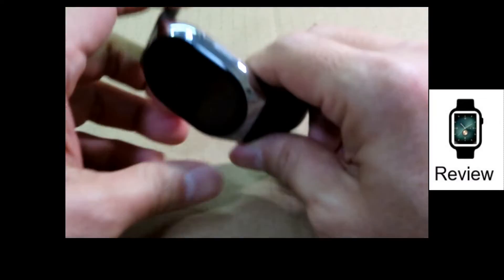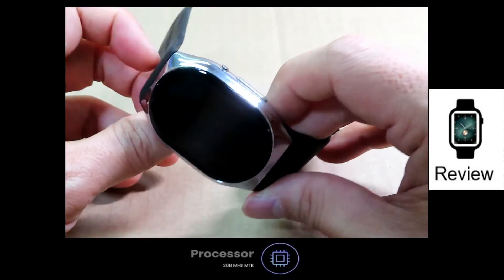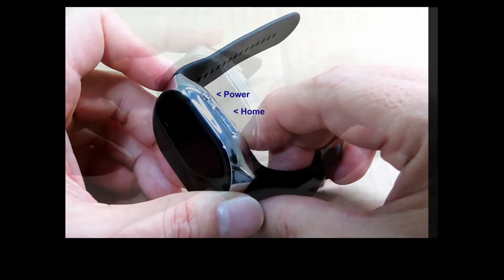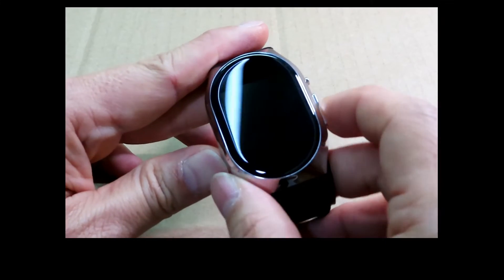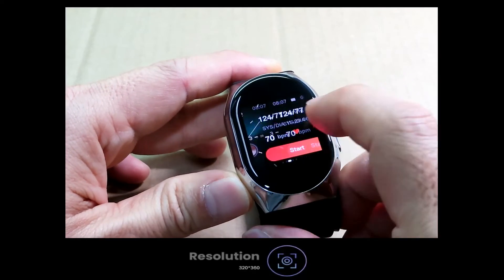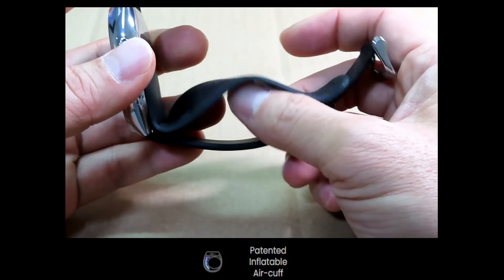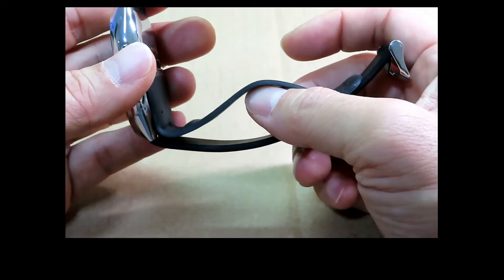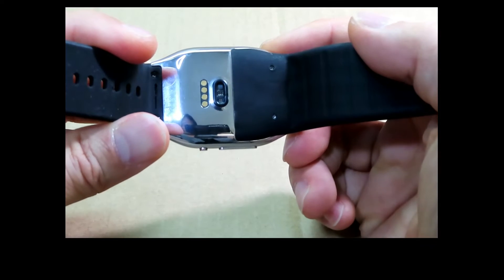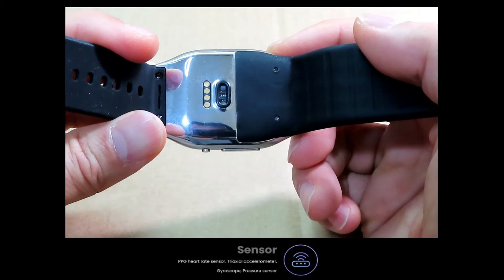Let's take a look at the watch. It's made of medical grade stainless steel — very solid material. It has two buttons: the power and the home button. The screen is a 1.4 inch AMOLED touchscreen. The unique feature is a patented inflatable air cuff that inflates to take your blood pressure with medical-grade accuracy. It has a PPG heart rate sensor, a tri-axle accelerometer, a gyroscope, and a pressure sensor.